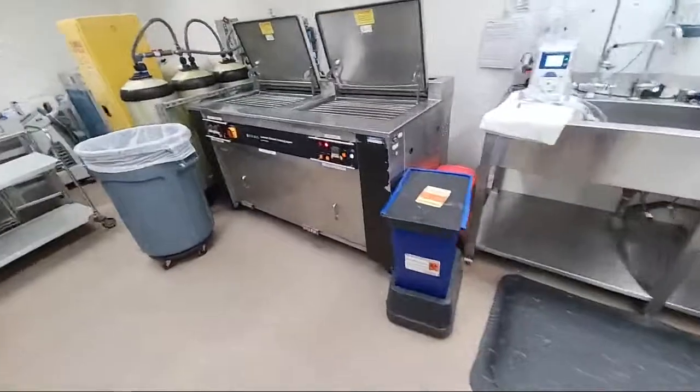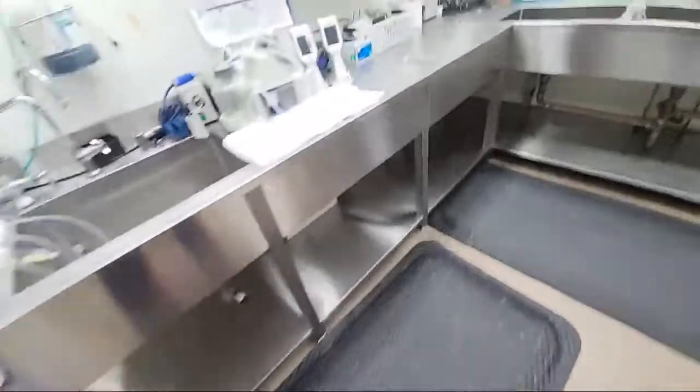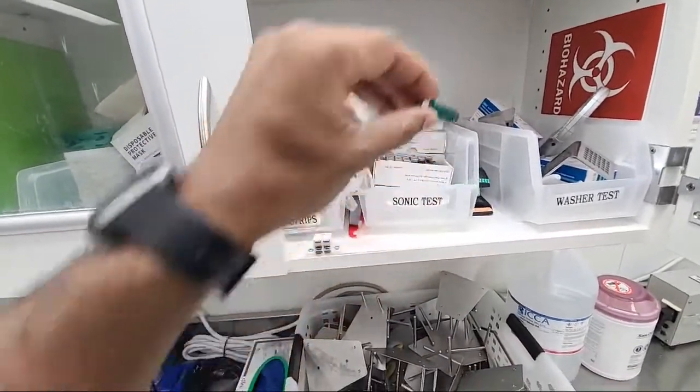What else? Oh, the ultrasonics. The ultrasonics, we kick it to start it. It runs for about 5 minutes. You can see there's a small little vial in there. Originally it is green, but it turns yellow after the test is done. So they'll do this test again in the morning. It's specifically for the sonics.